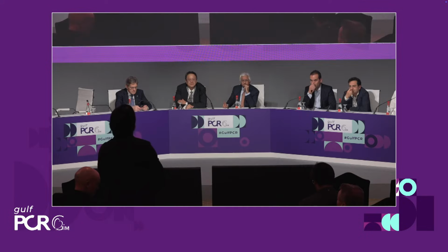Yes. I'm Dr. Ehsan from Rajaie Center with my friend Dr. Firouzi. We have implanted like 500 cases of Meril up to now, and I believe the pacemaker rate is pretty much less than what we actually got in the trial. It is like about 10%, I believe.